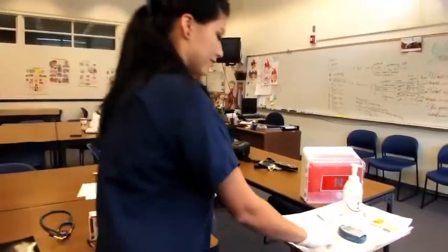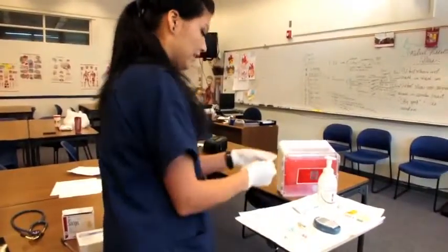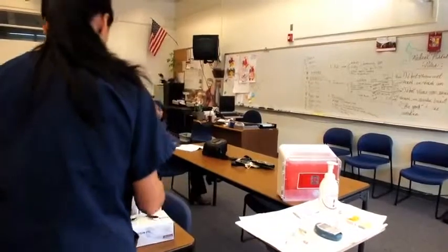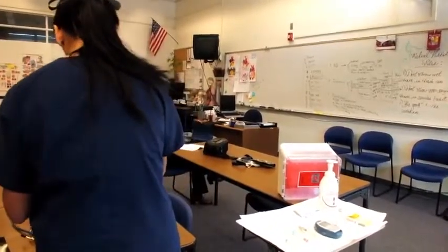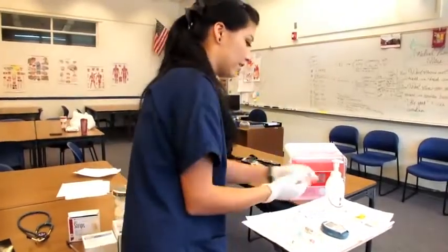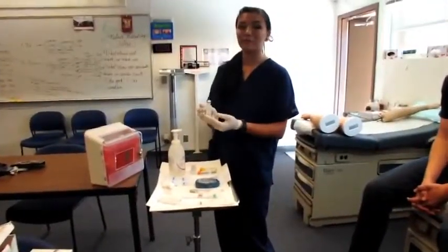And for this injection, I'm going to need a syringe and a 23 gauge and 1-inch needle. Okay, I'm going to grab some cotton balls, a Band-Aid, and alcohol wipes. Okay, so I'm going to perform my 3 checks.